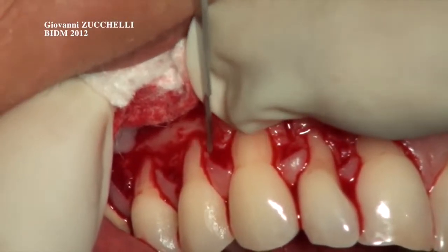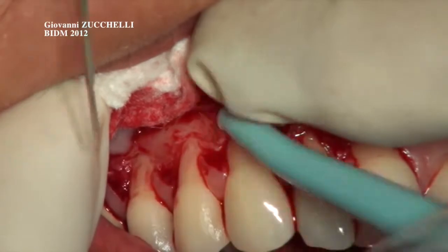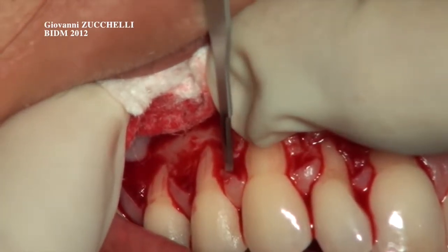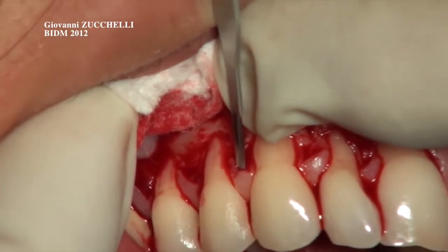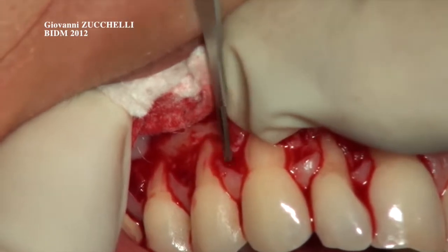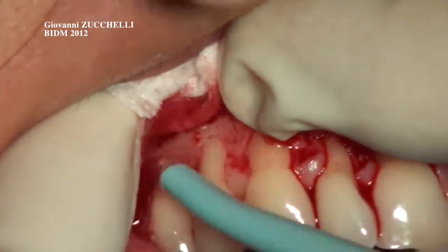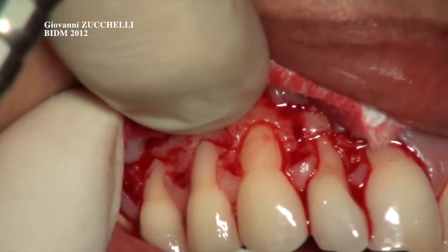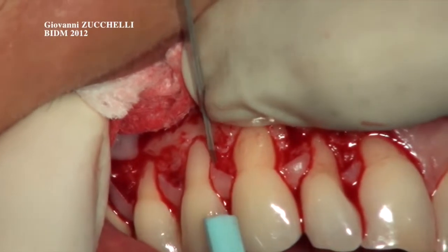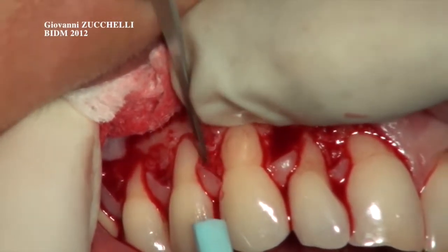You see that I know where. Please suction here. Thank you very much. I just have to remove the epithelium from here. So open a bit. Once the epithelium is detached, suction here, you have to wait here with your suction until the epithelium is detached from the connective tissue.